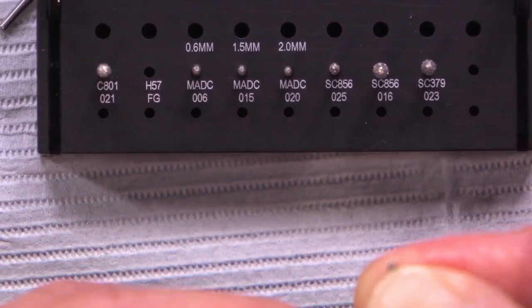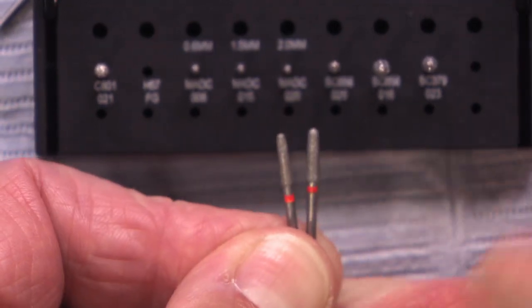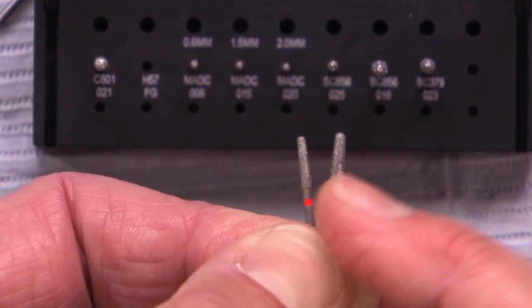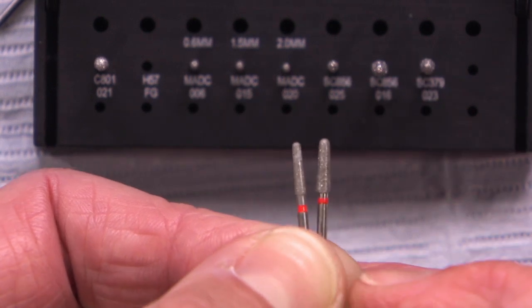These two burrs I started using when I started taking digital impressions. These are the same as our other two burrs. These are the 856 burrs, an 025 and an 016, but this is in a fine grit. So you can tell by the red stripe and just looking at the particles here compared to the super coarse ones, that these are much smoother.